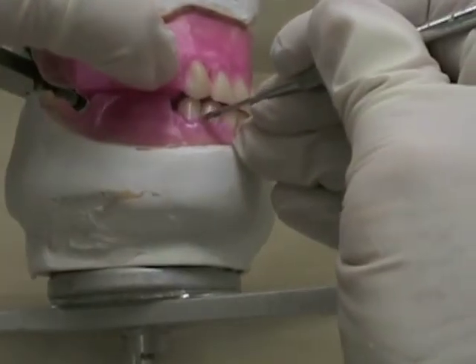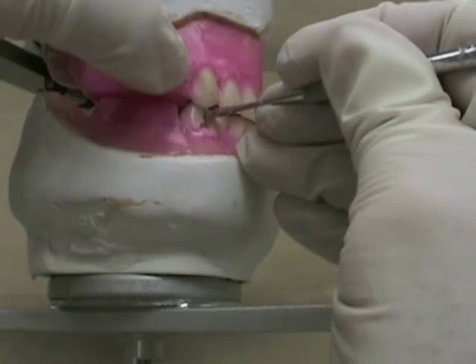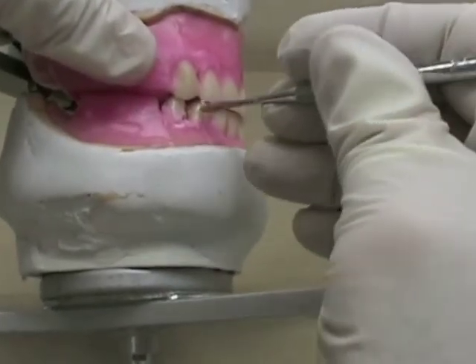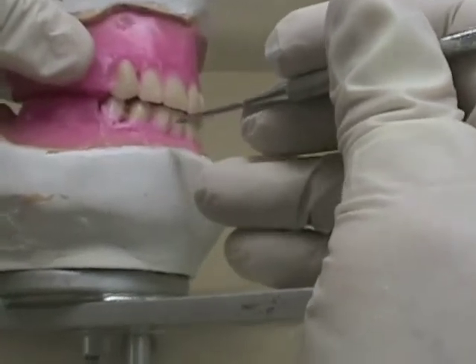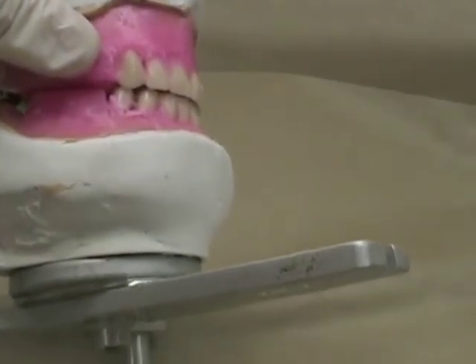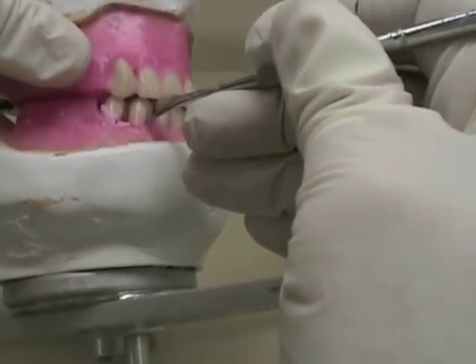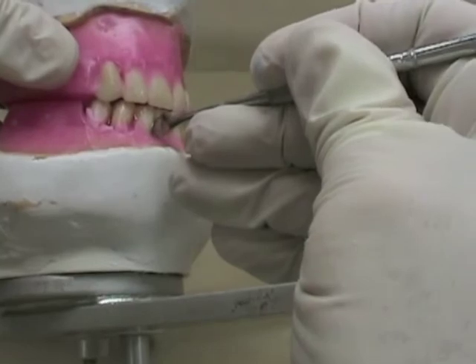I'm going to move the premolar back to where I want it to be. I'll end up with a little bit of a gap between the teeth, and what I'll have to do is move the rest of these anterior teeth around just a little bit at a time. There might be a slight bit of spacing between them, but if I spread that out you'll probably never even notice there's a little bit of extra space.